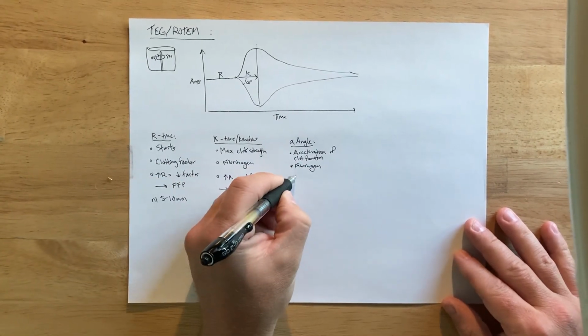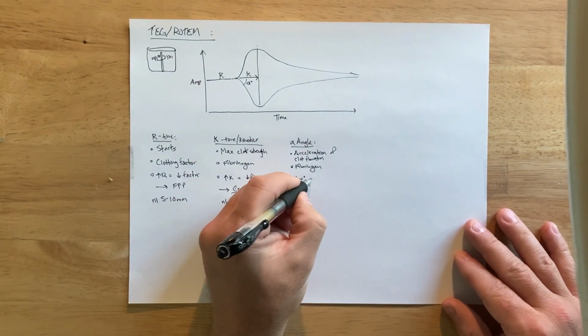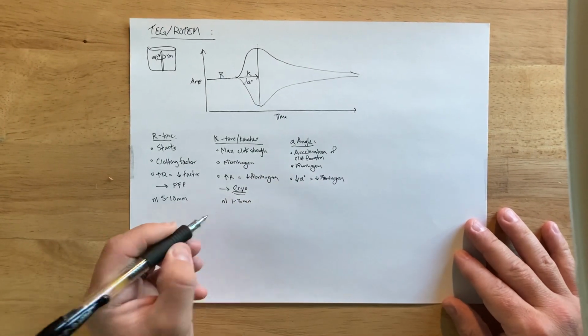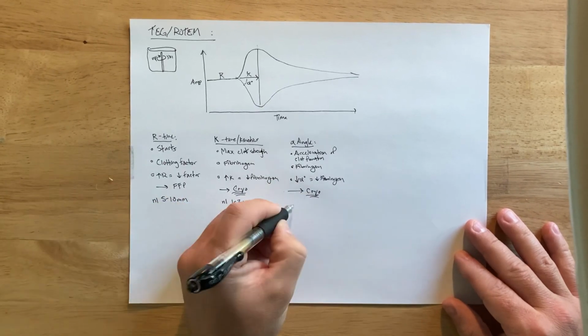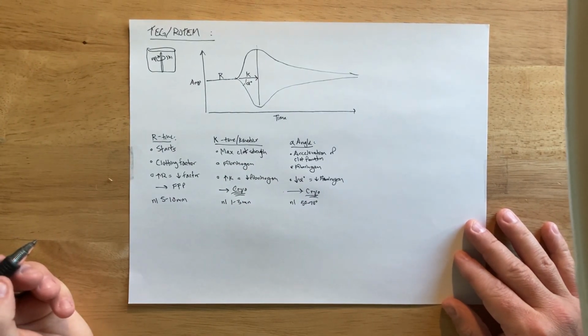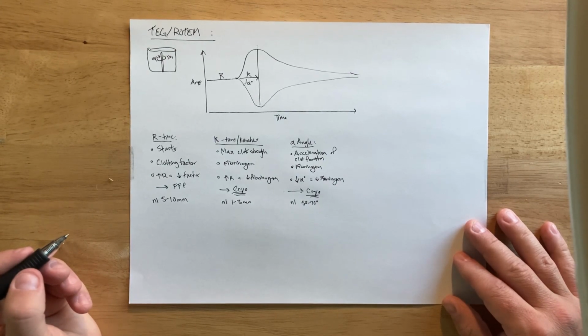And so if your angle is low, that means you have lower fibrinogen or function. And what you need to give these patients is cryoprecipitate. And a normal range for this is anywhere from 50 to about 70 degrees. Okay, so any lower than 50 is when they need cryoprecipitate.